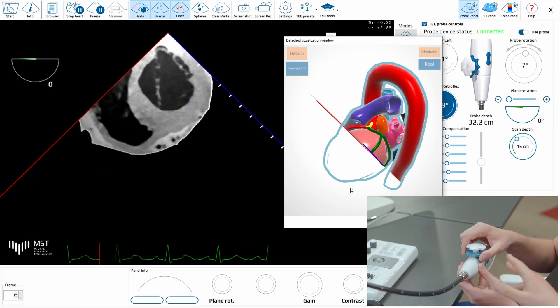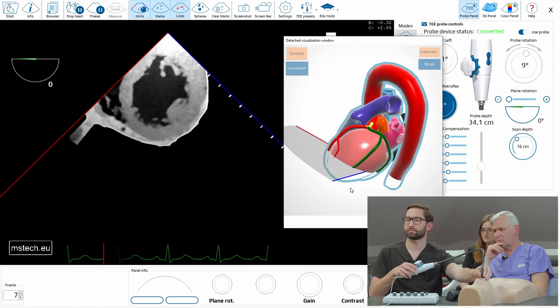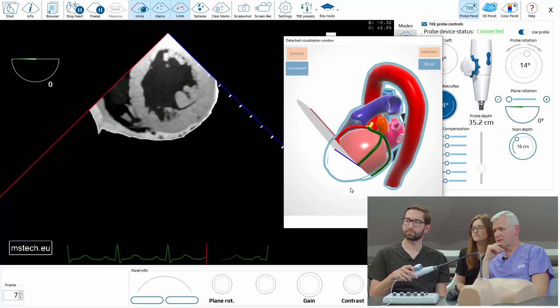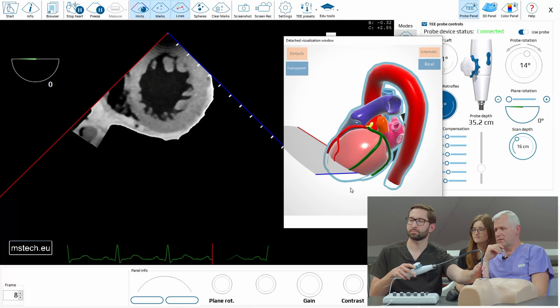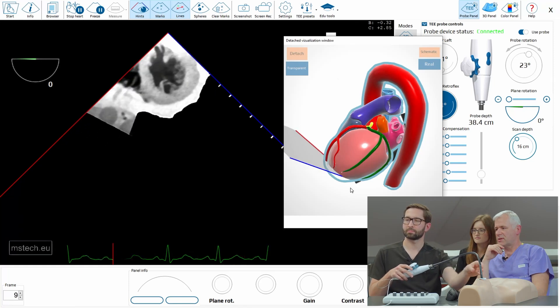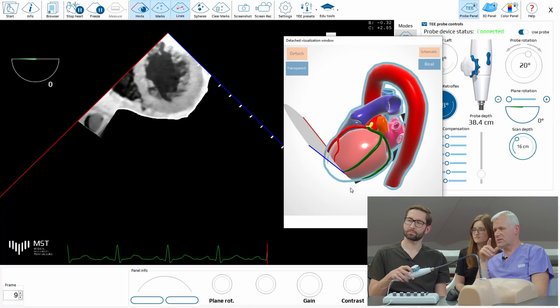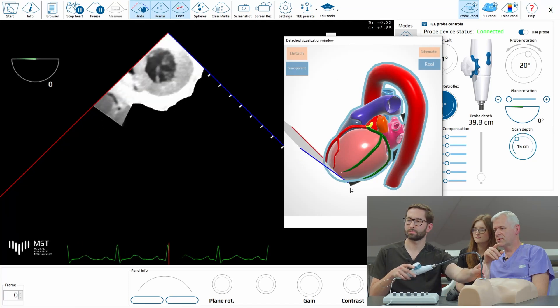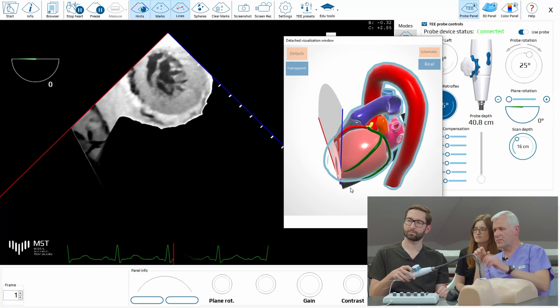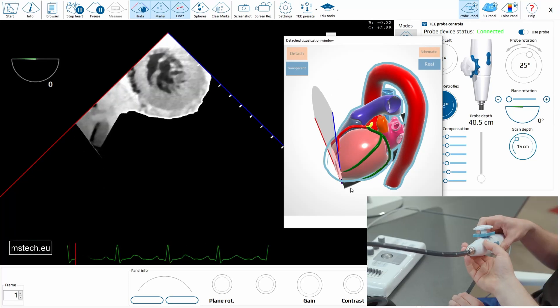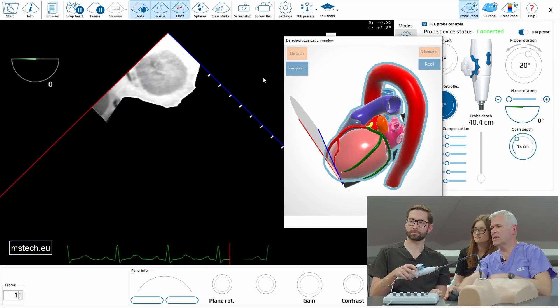Then release, go deeper, and show the papillary muscle level. Then release again, go even deeper, and show the apical level. This is the very apical part of the left ventricle.